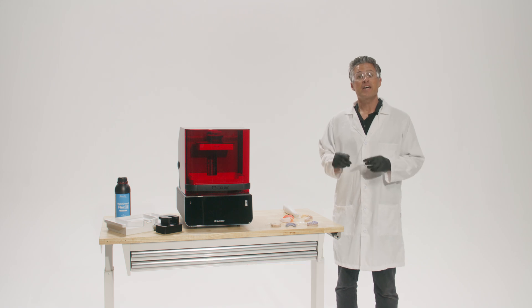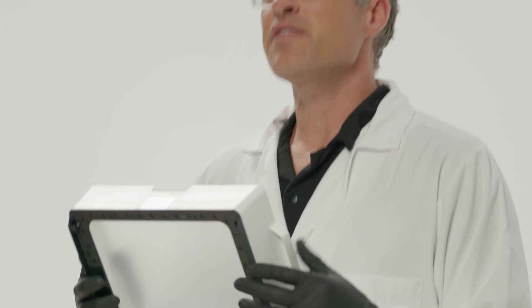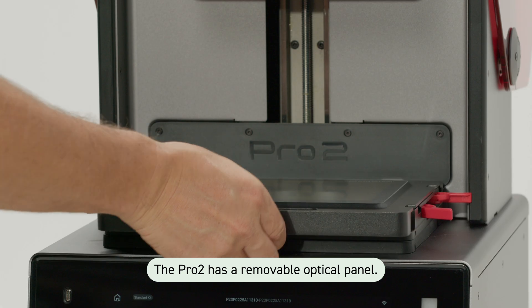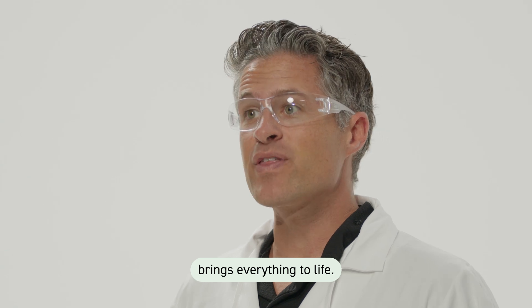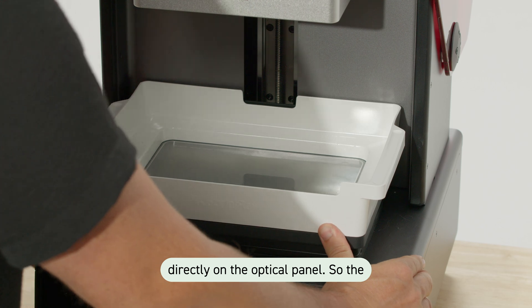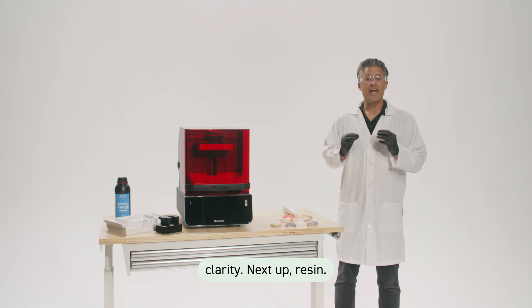Now let's break down how this actually works. This is the resin tank. See that clear film on the bottom? Think of it like a flexible window. The Pro 2 has a removable optical panel. Underneath that, a precision glass window. And below that, the light engine that brings everything to life. When the tank is seated, it rests directly on the optical panel, so the light passes straight through the glass and the tank film with perfect 35-micron clarity.